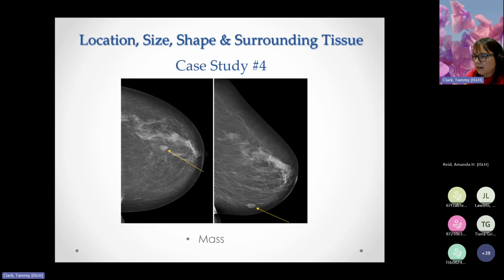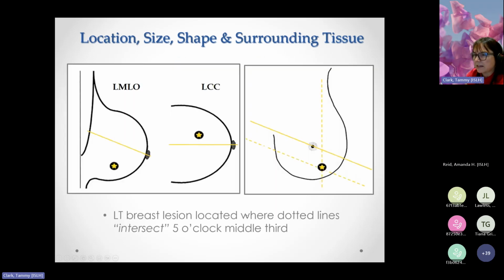So this here is your mammogram. Again, this is between a B and a C density breast. This patient has clearly a mass. It's the same because it's the same distance back from both views. It's the same shape, and we can see it in two views. So we're looking for a mass here.